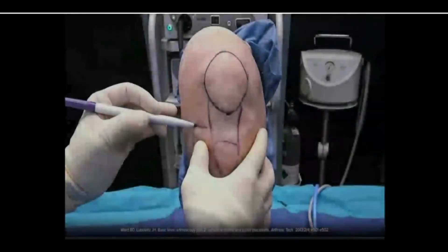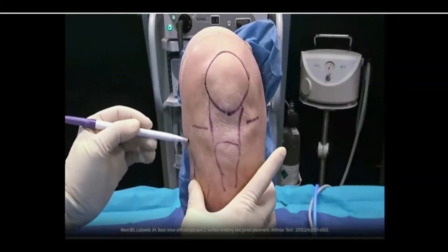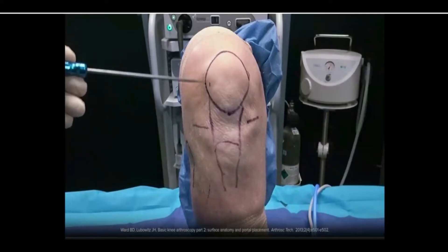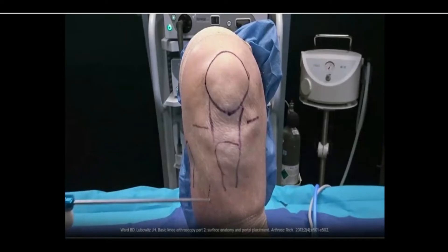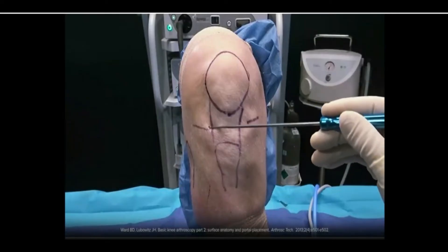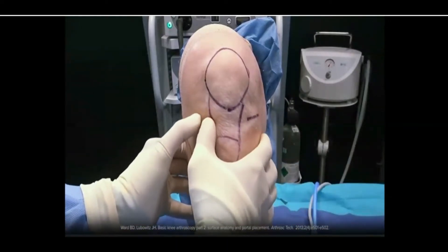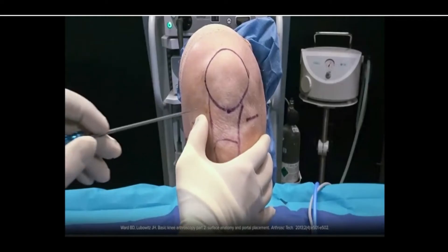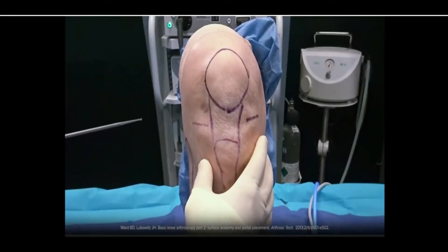Once the sterile surgical site has been prepared, it may be helpful to use a skin marker and outline known bony anatomy prior to starting the procedure. These markings commonly include the patella, patellar tendon, tibial tubercle, and the head of the fibula laterally. Portal placement is often referenced from the edges of the patellar tendon as well as the level of the medial and lateral joint line. Typically, the lateral joint line is palpated just a bit superior to the medial joint line. Marking these locations is helpful to find the correct starting point for arthroscopic portals, where a palpable soft spot is identified.